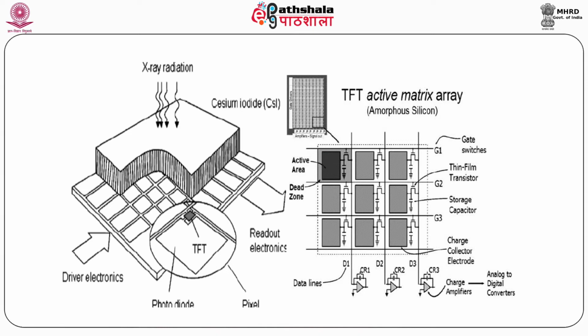So, this area is not utilized in converting the light signal into an electrical signal, as in the case of either a charge coupled detector or a TFT. In both detector technologies.